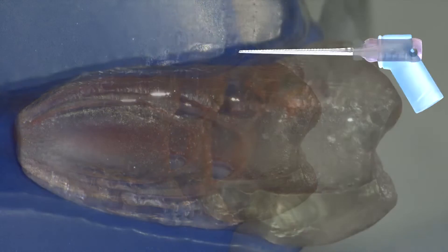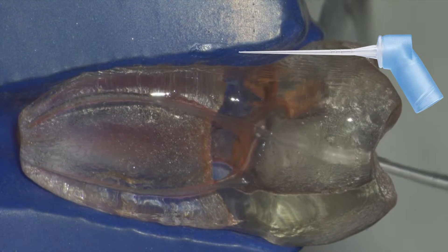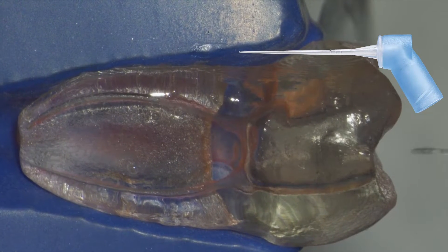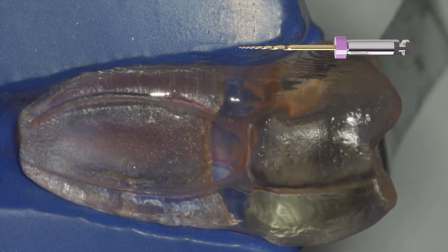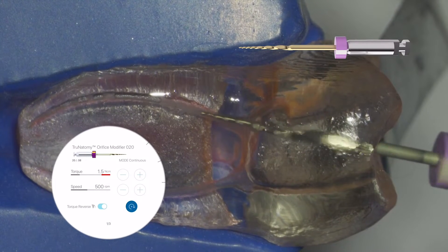You want to leave irrigant in the canal as your lubricant, using the True Anatomy irrigation needle. It's okay if you leave irrigant in the pulp chamber as well. Remember, this is really passive irrigation that's going to take place during your instrumentation.